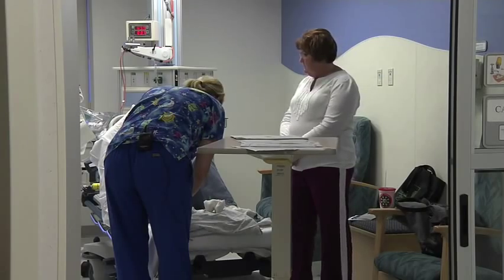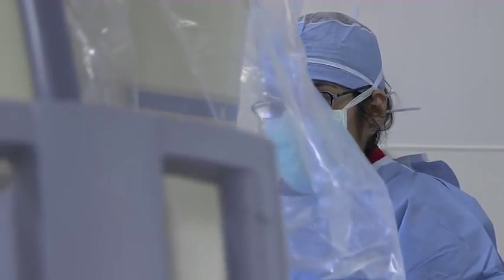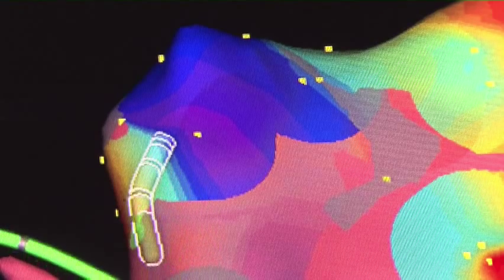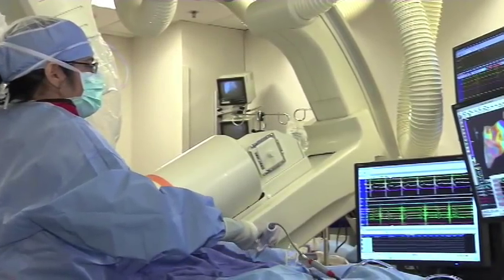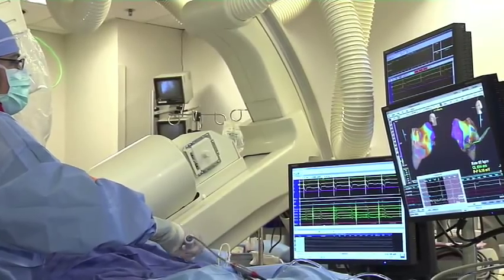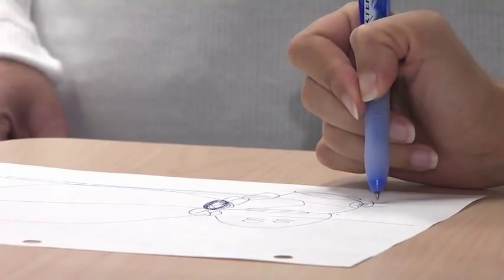They're going to go up through my groin and into my heart and burn the scar tissue that's there. I'll see you inside. Catheter ablation works very, very well. It's a type of heart catheterization where we place catheters through the blood vessels into the heart. We map the abnormal pathways in the heart, and then we cure the heart problem. So the plan's going to be to go up there, map, find the flutter, and ablate the flutter.